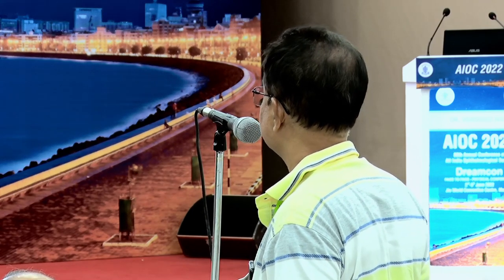That's the advantage, and one should always use pupillary expansion devices like she used, the Malyugin ring, because that gives you proper visibility and you can assess the size of the rexis nicely. If you do a case through a 3.5 to 4 millimeter pupil, you can't really assess it properly. Of course, you can use Kuglen's hook to stretch the iris and see all the sides, and you can do all those maneuvers also. But when you have pupillary expansion devices available, one should use them.